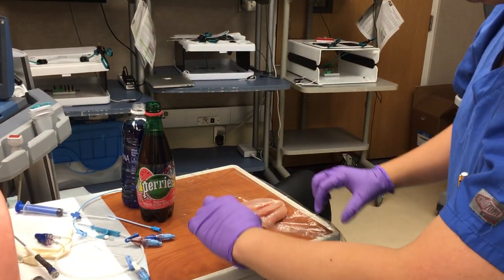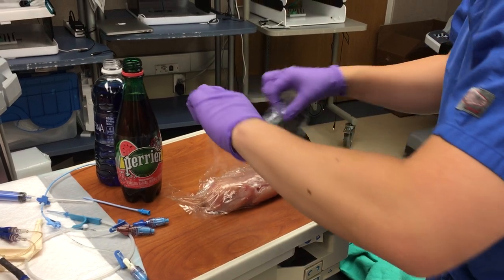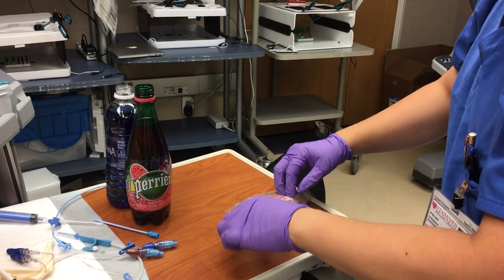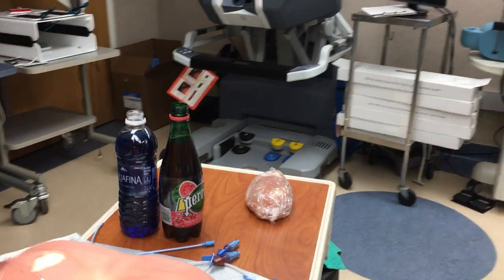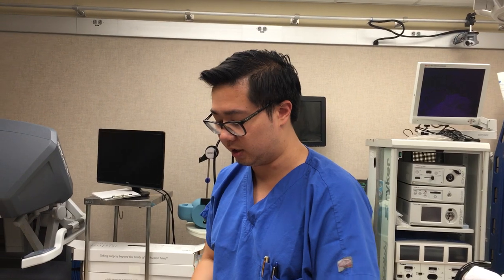Next is to wrap it in saran wrap, like so. The step after this is to insert the spike through and to channel the tubing through the chicken.